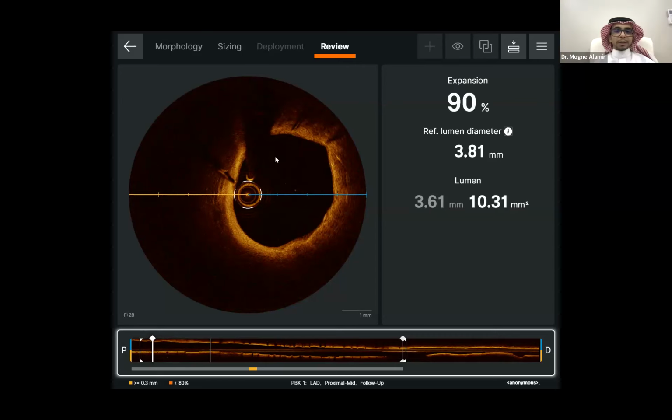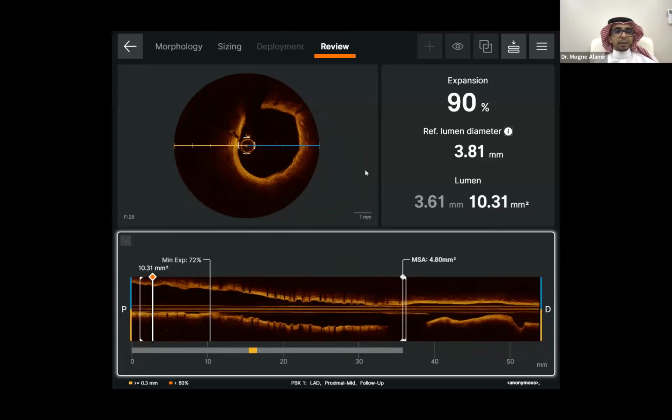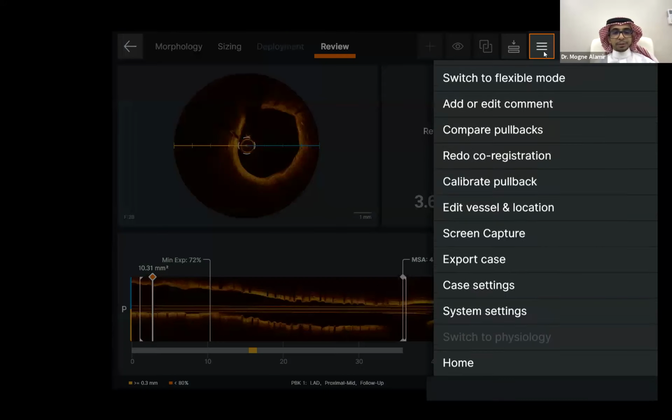Perfect. It's amazing how within just 4 weeks the stents start to be healed. That actually gives us some confidence that if we need to stop dual antiplatelets and just continue single antiplatelet therapy in a patient with a high risk of bleeding, we can consider it. With this imaging, it makes us understand the healing process better. Yeah.